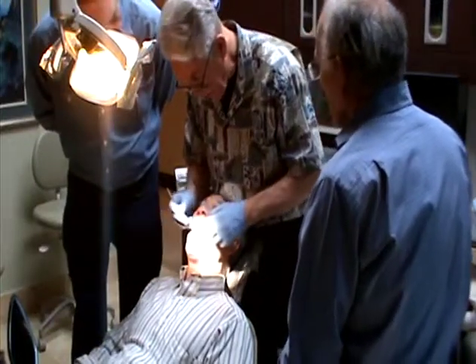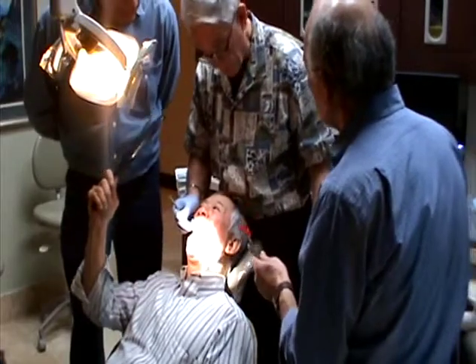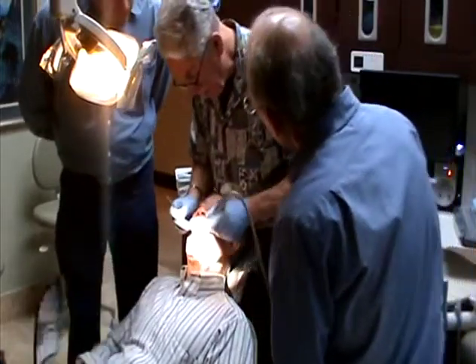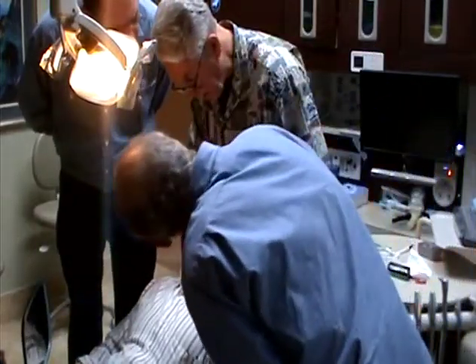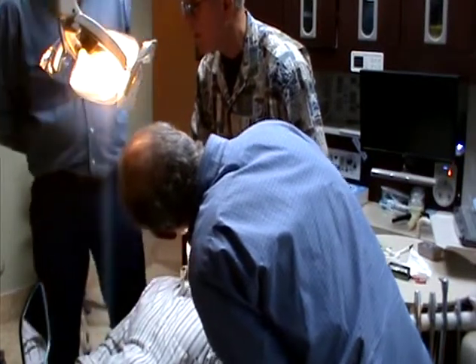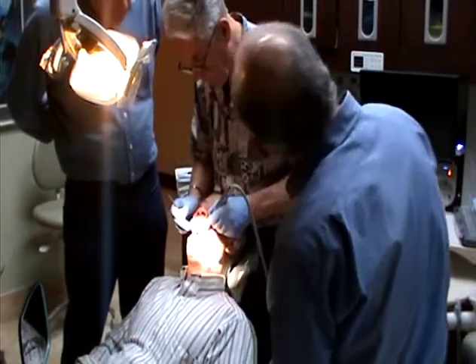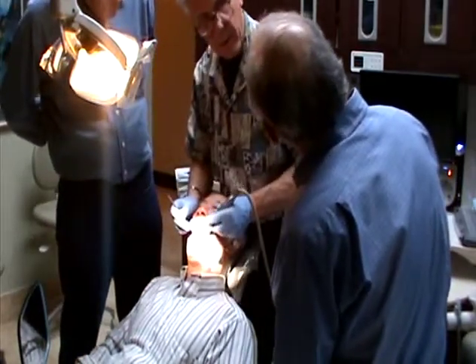But you want that centric stop on that incline. Well, that's my question. But the point was, when he slid out there, the centric stops on that incline, but he had to bump over this edge to get past it when he tried to slide to the right. So I'm not taking out that centric stop, even though it's on an incline. I'm taking the bump out, that's all.